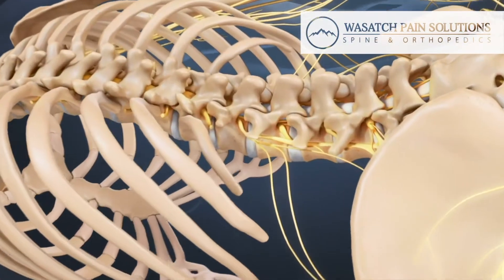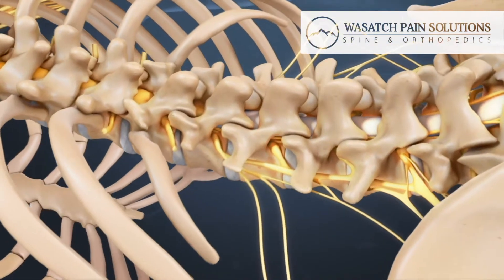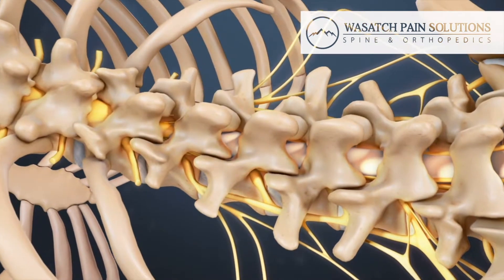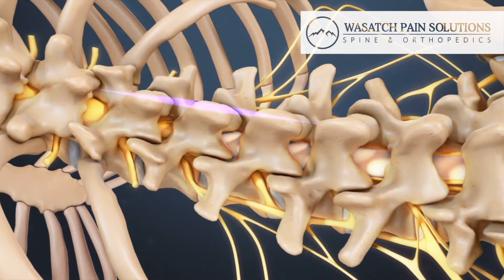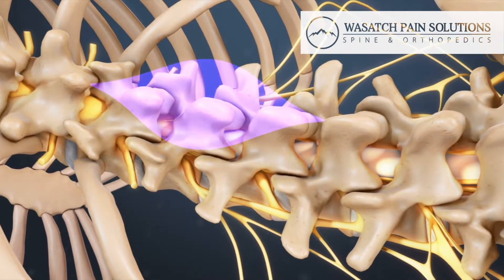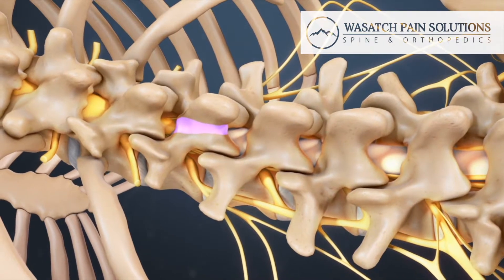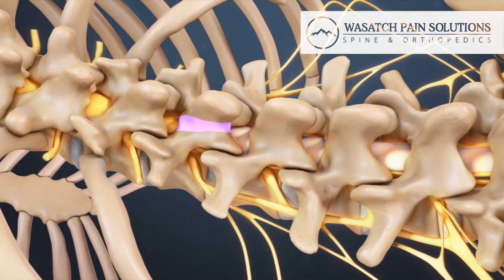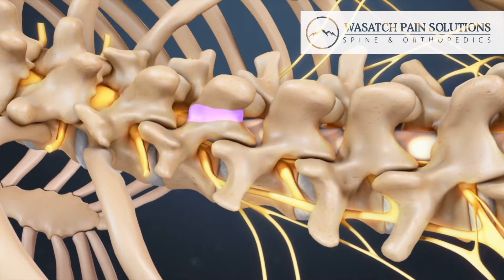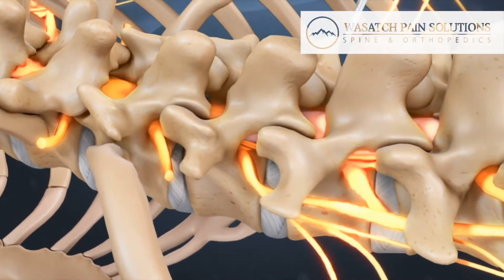Permanent implantation is similar to the trial period process, but with some extra steps. First, an incision may be made to allow removal of part of the lamina, a small bone over the back of the spinal cord. This makes room for the larger leads, often used in permanent spinal cord stimulation.